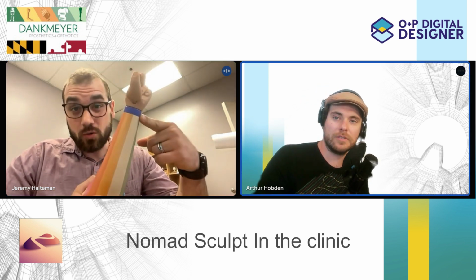But then some of the other sister apps that we've been using, you should check out. Shaper 3D is really good for iPad CAD. It's very traditional CAD, but it's very good. It's not quite as advanced as Fusion. You can't do the whole T-spline workflow. But if I just want to draw a basic wrist like this, it is stupid quick. It is subscription based, so it's kind of expensive-ish. I mean, it's fine.